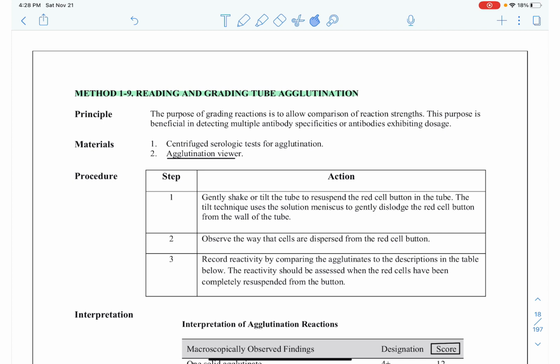Although this procedure method is rather simple, the value of reaction strength in patient testing can become complex and very valuable to know. Because antibodies do not always react as they should, and our testing is limited by the reagent source, in real life technologists rely heavily on the strength of reactivity to narrow an investigation. Some examples in which strength of reactivity is important include variant antigen expression during phenotyping, HTLA investigations, and even failure in quality control and more.